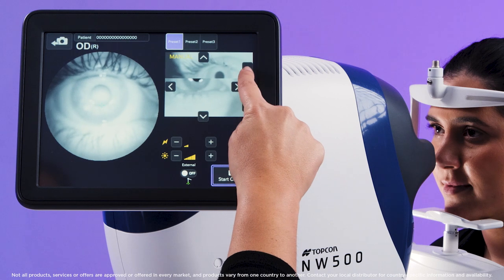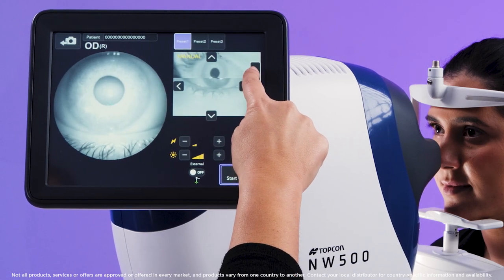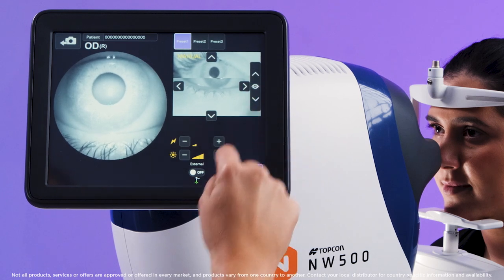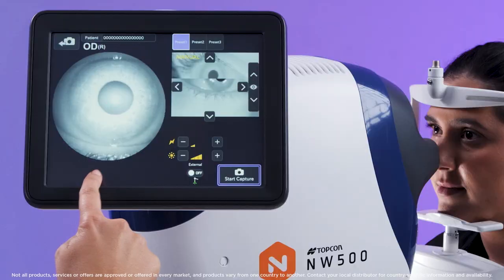To focus, press the up arrow on the far right side to focus the iris. Once the iris is seen clearly in the live camera view here on the left, press start capture.